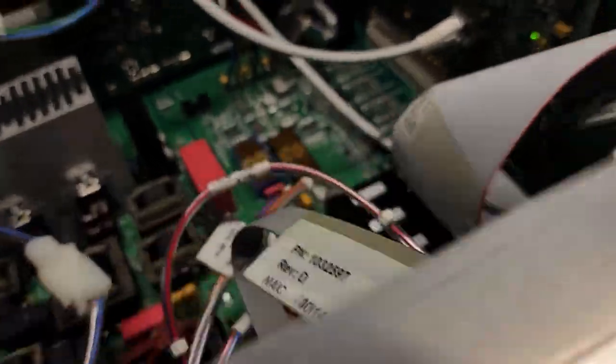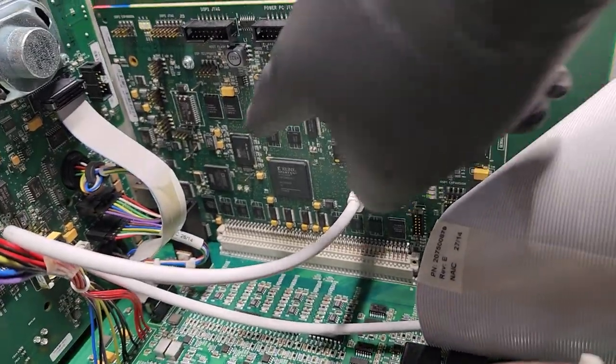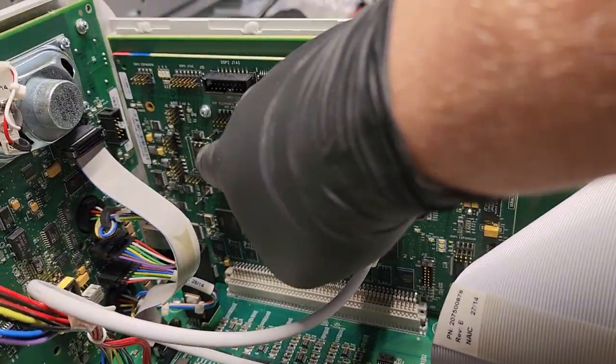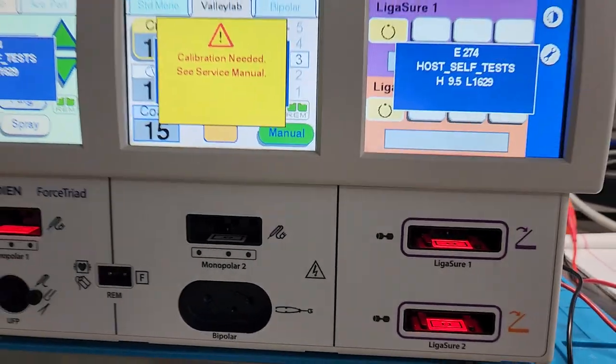Well, on the inside, this right here normally has a battery that's socketed right over here. That battery maintains your calibration values. Now this little timekeeper is a general part that you can find anywhere, but this little battery is responsible for keeping the calibration values.